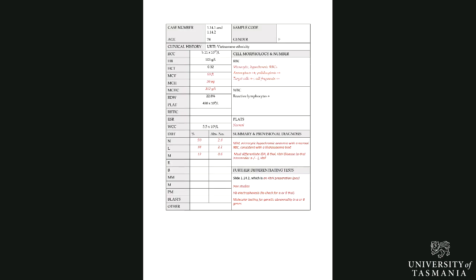On to the third one. Here we've got a 24-year-old female with an upper respiratory tract infection. Once again, she's going to the doctor with something other than feeling tired and unwell and anemic. She's got an infection going on here. We look at her hemoglobin, it's 101, so she has a mild anemia. Again, a very robust red cell count and a low MCV, which suggests she's got some sort of abnormal hemoglobin here.